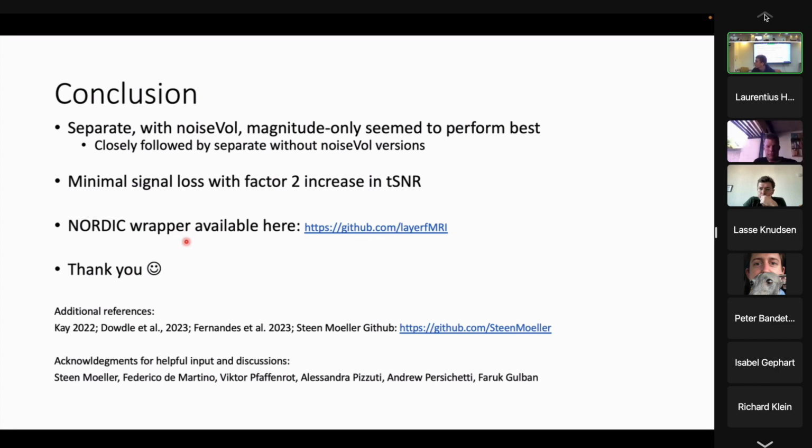Maybe it doesn't work the same way, I'm coming from fMRI data. Have you looked at the independent components that you're removing, to see if, when you're losing signal, it's just a few of them that are the problem, or you're losing the signal equally distributed across the whole set of components? Right. Yeah, I haven't looked specifically at the components we're removing, but we have been looking at, again, this difference time series, which represents what Nordic is removing, right? No, I'm just thinking, if you could identify, for example, that it's just a few, then you might better understand what's going on.